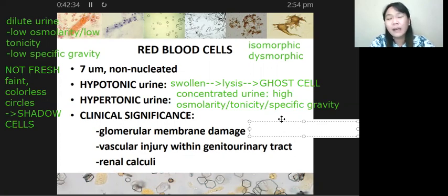Okay? Ayan, ang nagiging problema dito is that, okay, some references will not categorize a particular red blood cell as dysmorphic kung iisang bleb lang ang meron. Kasi pag dinedefine nila ang dysmorphic RBCs, lagi nilang sinasabi na presence of blebs or protrusions.